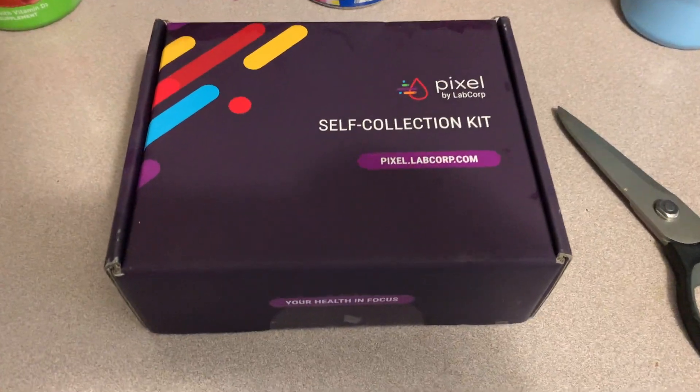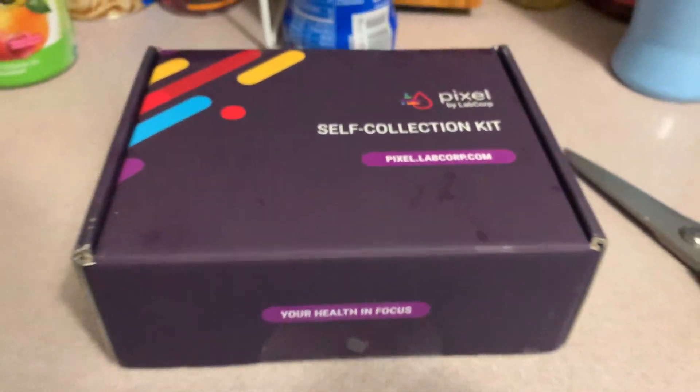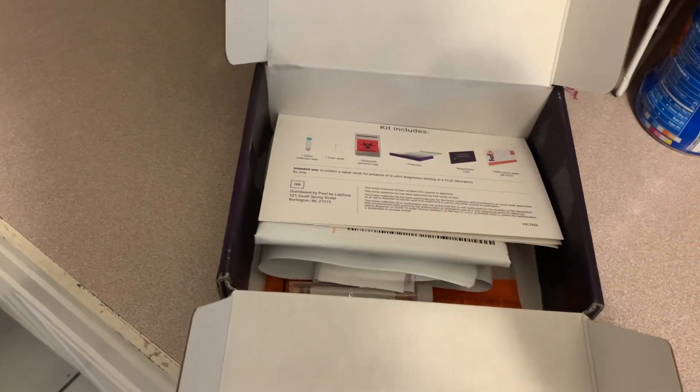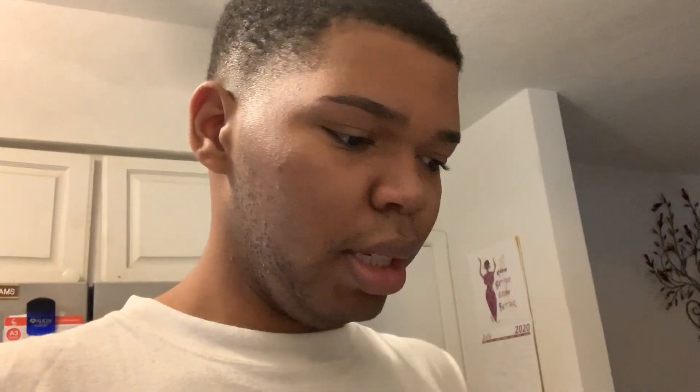I'm just going to say this now — it is thunderstorming where I live right now, so the lighting is probably going to be iffy. And if you hear thunder and stuff like that, that's the rain outside. You've been warned. This is the package that it came in. 'Your health in focus.' Hashtag unboxing my coronavirus testing kit. This looks dangerous.